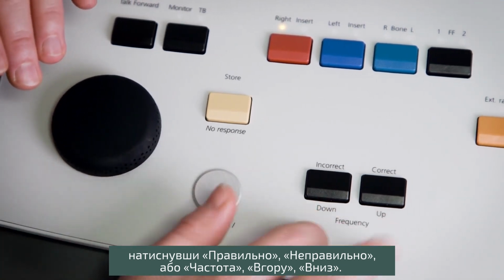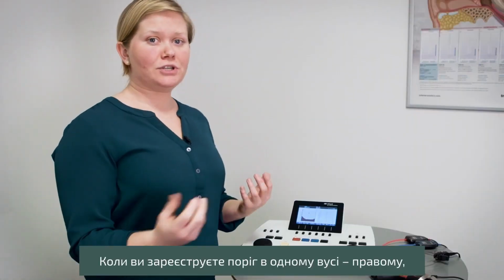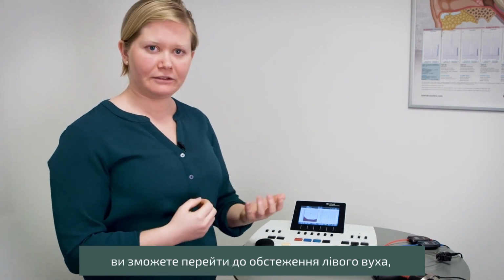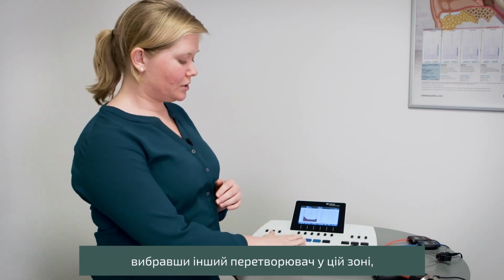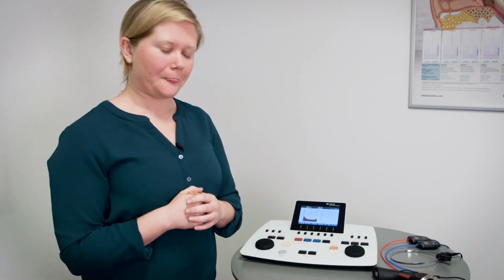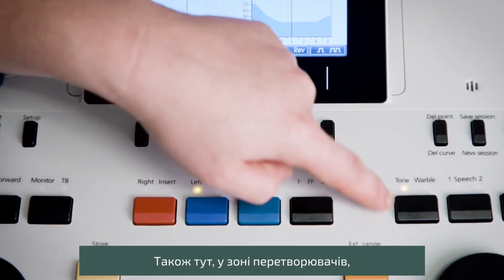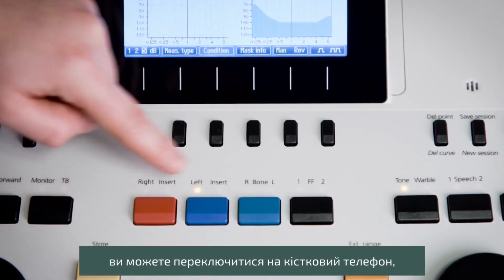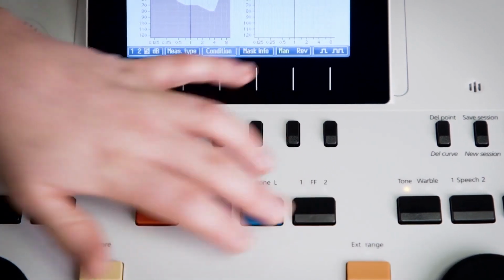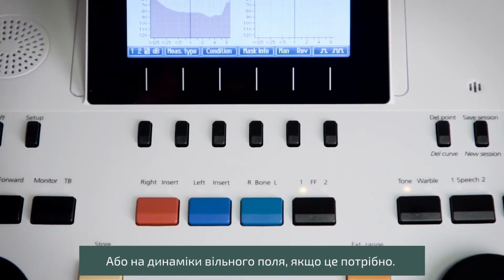Once you obtain the threshold on one ear, the right ear, you can move on to the left ear by changing the transducer in this area here, where we have the change of the transducers. It is also from the transducer area that you change to the bone conductor when you want to obtain your bone conduction audiometry, or your free fields if that is needed.